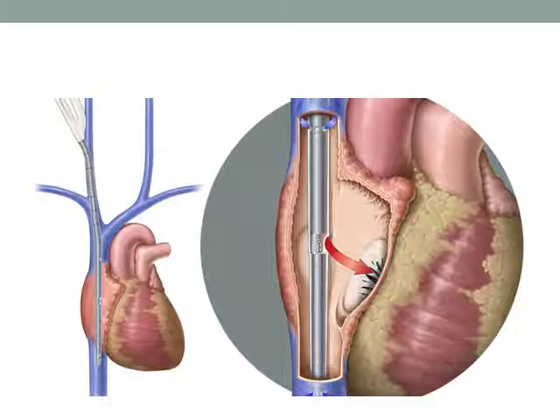So hopefully we have standard pressure gradients, so that blood flows from here through the tricuspid valve into the right ventricle, which contracts, and now it's squeezing pre-oxygenated blood. So remember, the blood that normally the right ventricle squeezes into the lungs is blue blood having come from the body. In this case, though, it's going to be blood that is highly oxygenated. So it's already taking blood that has had carbon dioxide removed and oxygen added. So whether the lungs do anything or not doesn't matter too much because it's already been through the lungs, just the outside lungs.